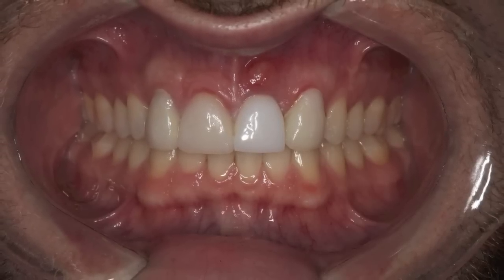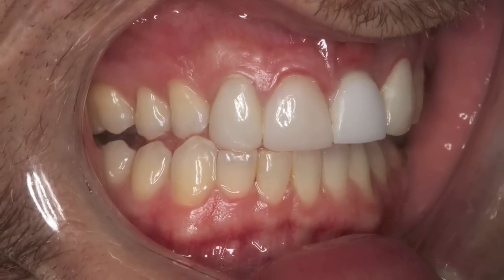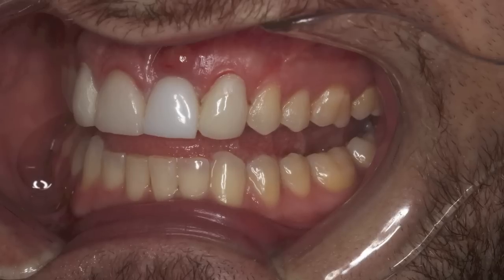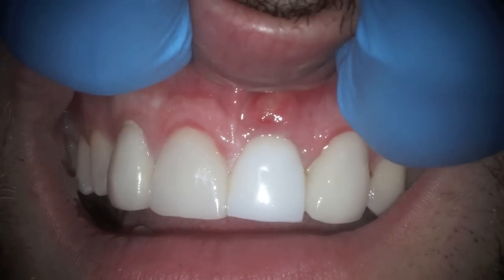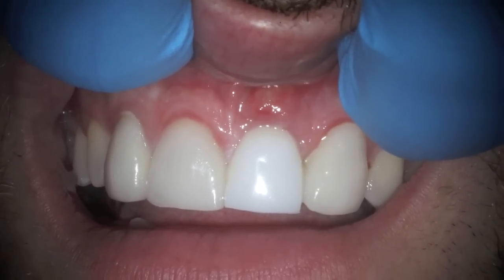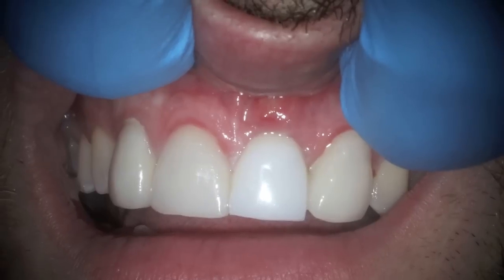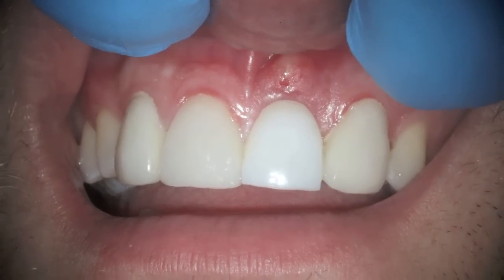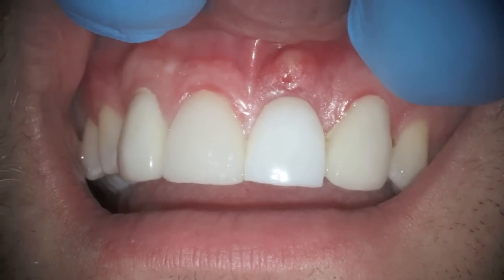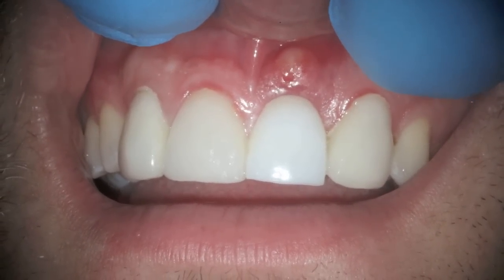Here's the initial, the way the patient was brought to us. You can see the infection near the implant there, and here's a little videotape of the initial evaluation. We weren't looking at a constricted palate at this time, but in the process of looking at everything, realized that his tongue was not quite sufficient or didn't have enough space.